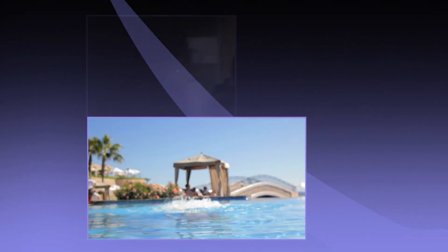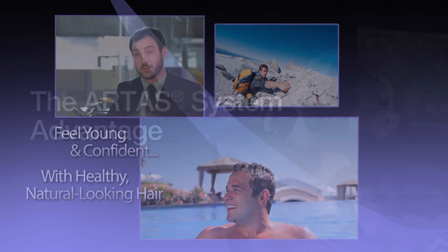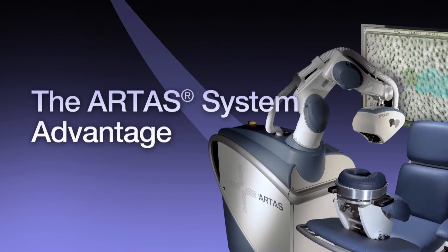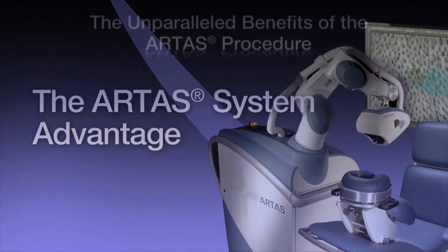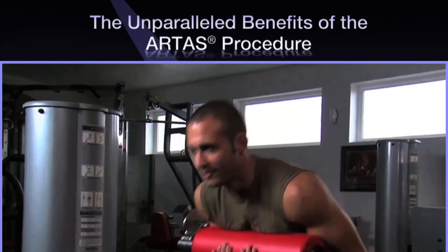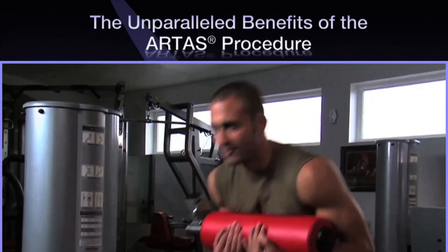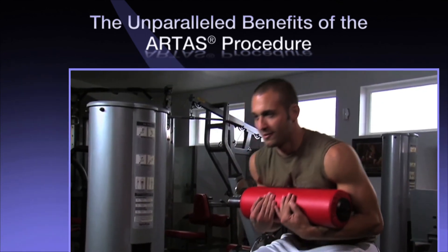The ARTAS system utilizes the latest digital imaging technology and precision robotics to help you keep that youthful and confident feeling with healthy, natural results. The ARTAS system is the first and only FDA-cleared, computer-assisted technology for harvesting follicular units directly from your donor area.